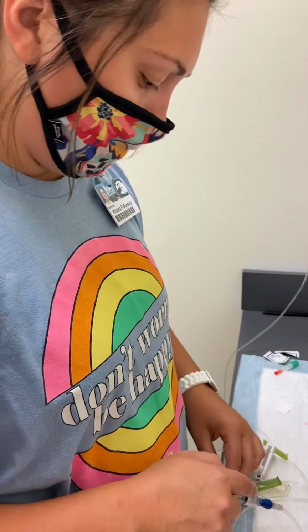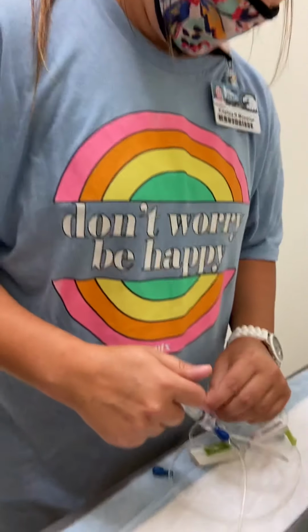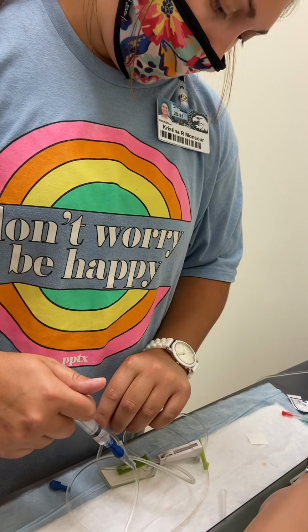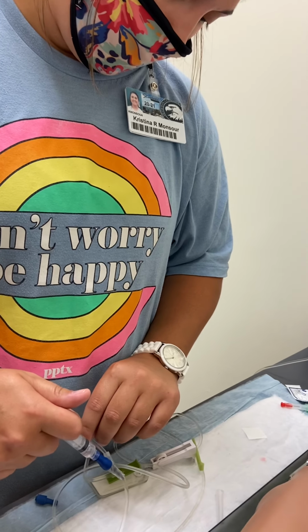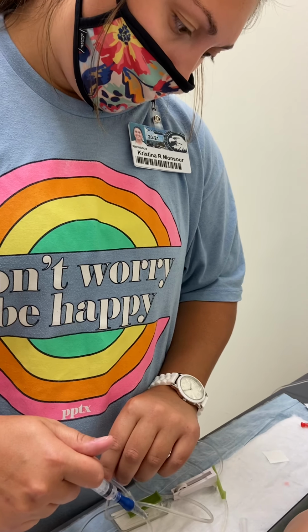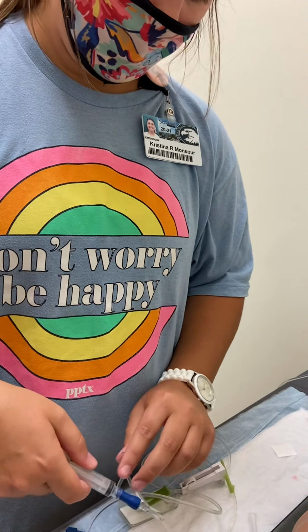Alright, it's been a minute, so I'm going to clamp it off again and finish the rest of my push. Alright.